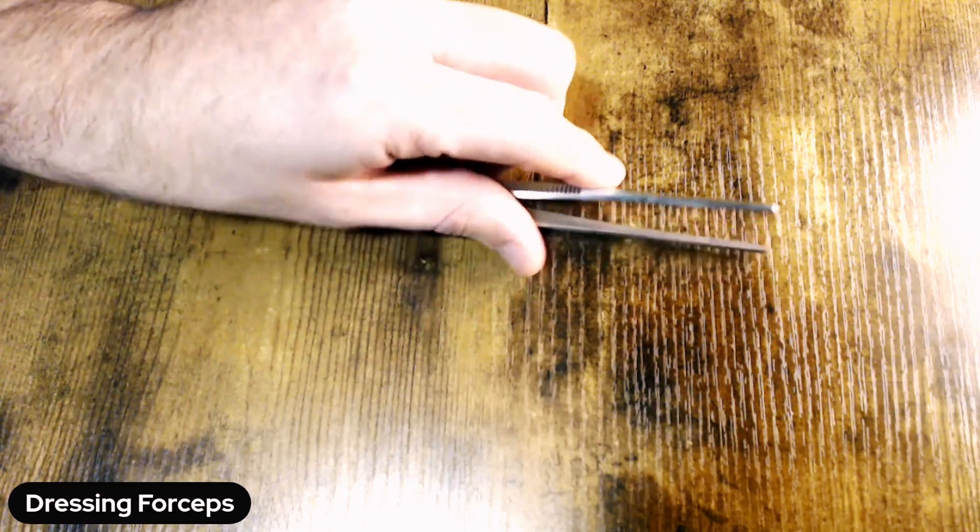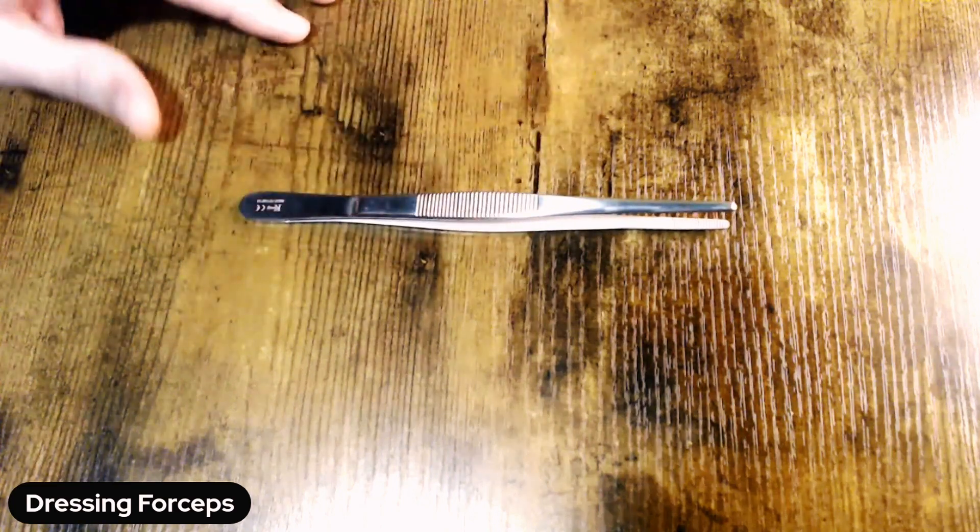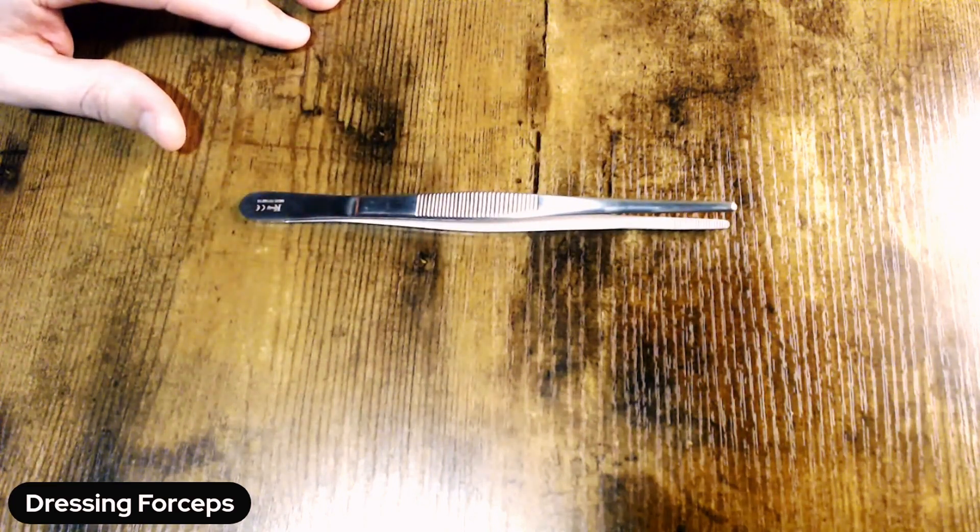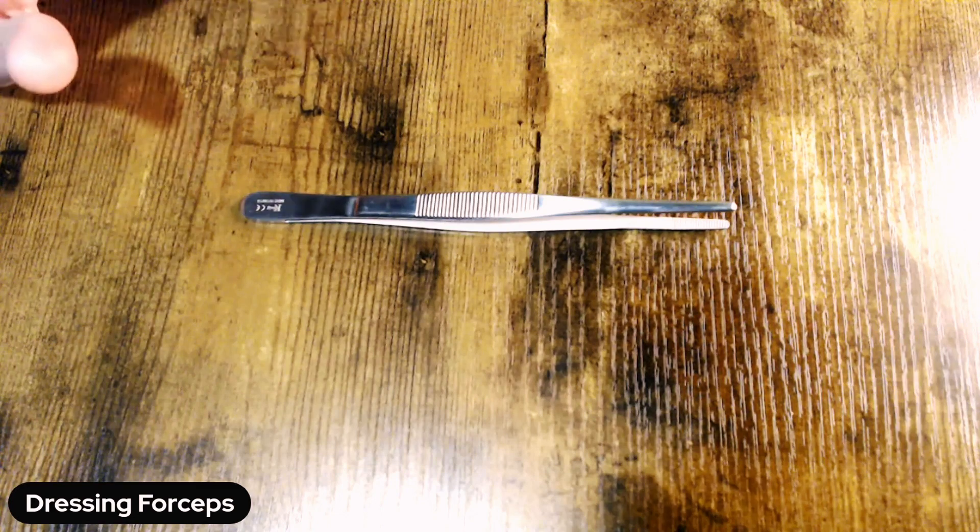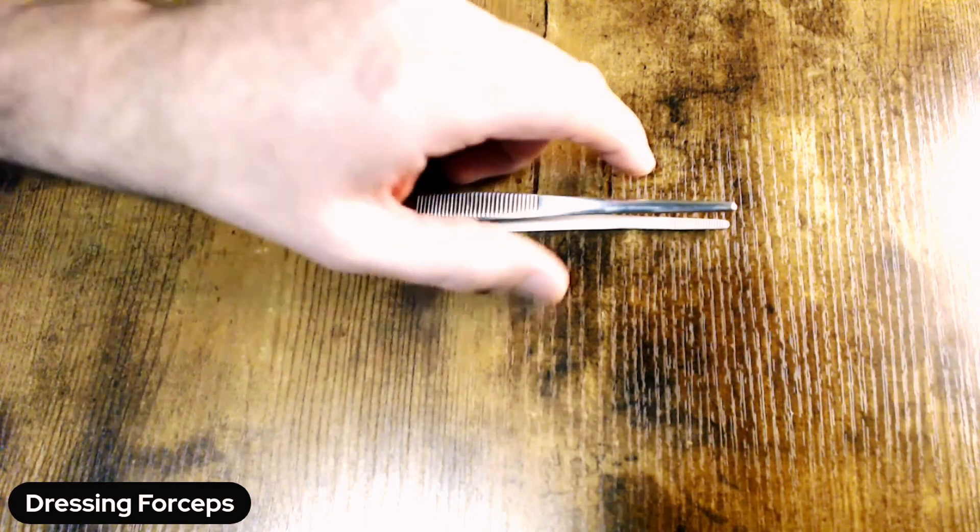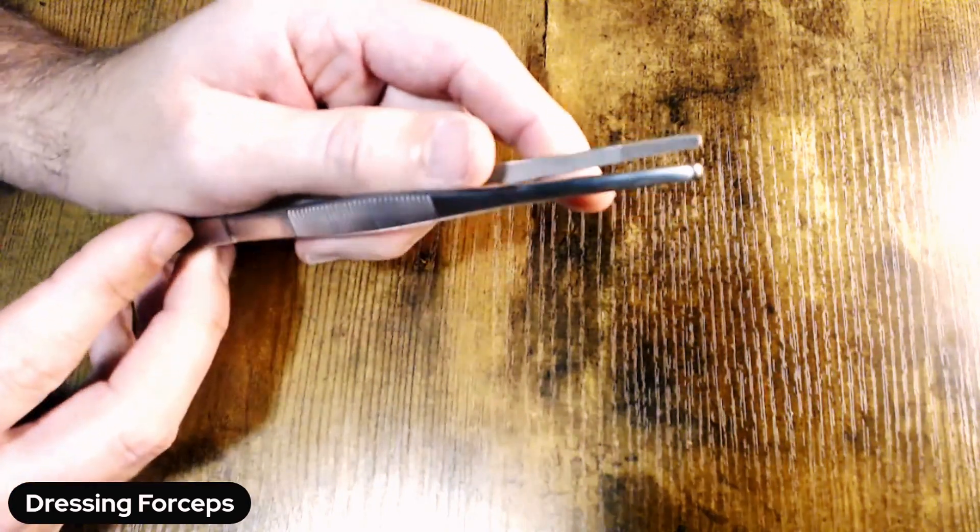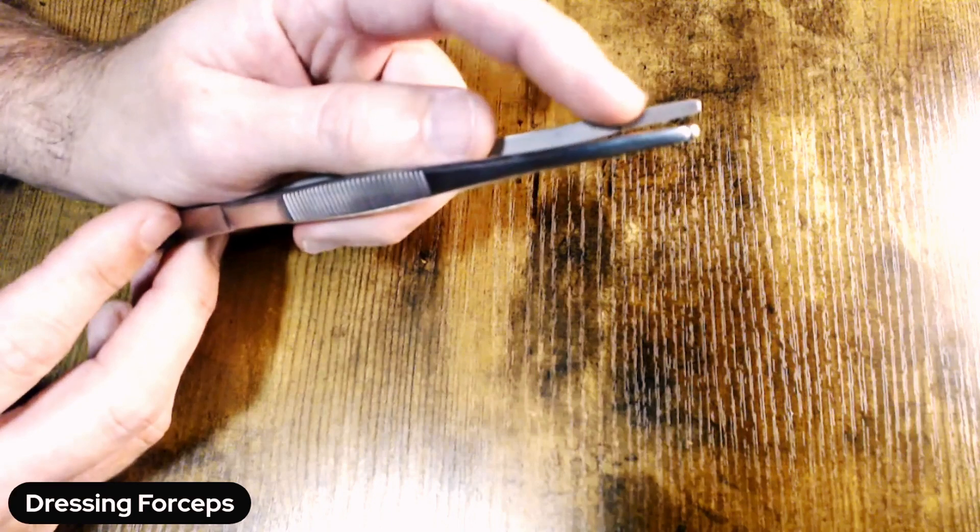If you've been in the industry for any time, you know that these go by a number of names, including a smooth forcep, which is a little confusing for newer technicians because if you look closely, there are serrations on the distal tip of this device.